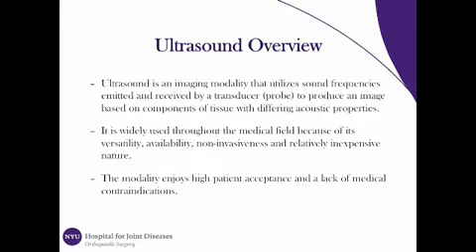Ultrasound is an imaging modality that utilizes sound frequencies emitted and received by a transducer or probe to produce an image based on components of tissue with differing acoustic properties. It is widely used throughout the medical field because of its versatility, availability, non-invasiveness, and relatively inexpensive nature. The modality enjoys high patient acceptance and a lack of medical contraindications.